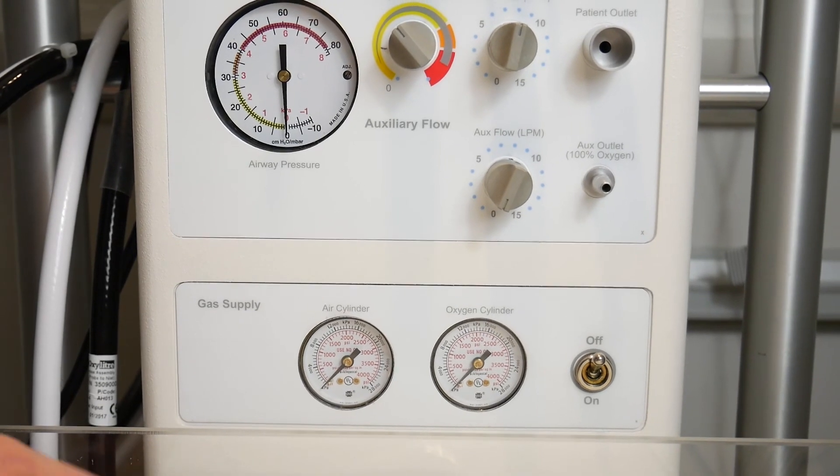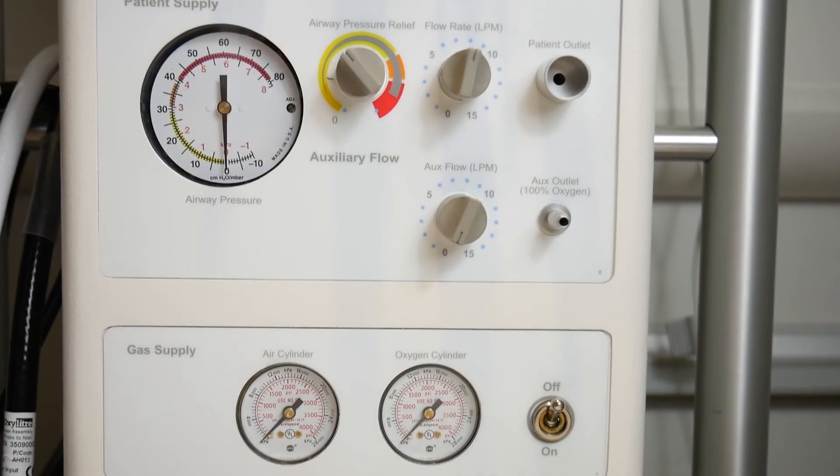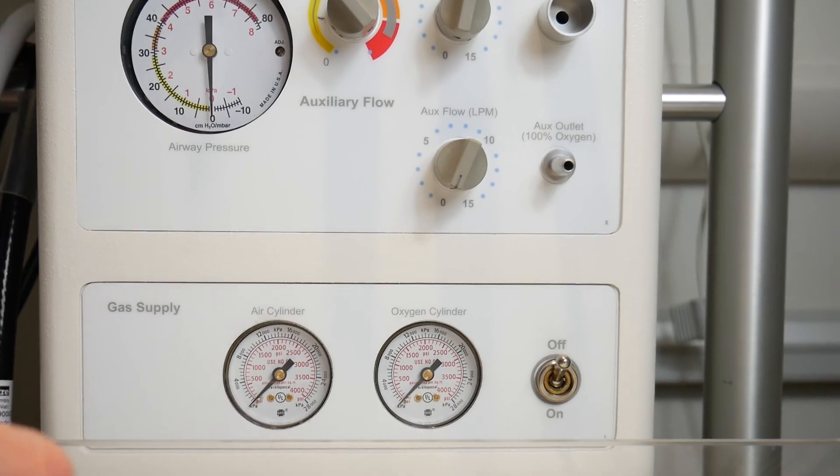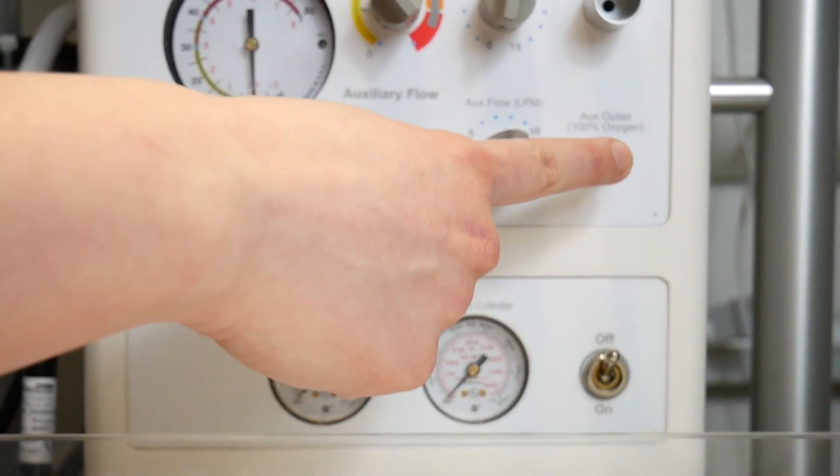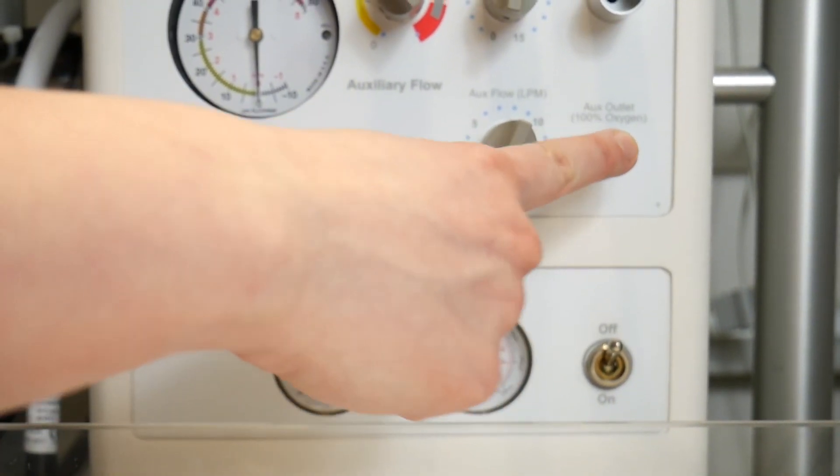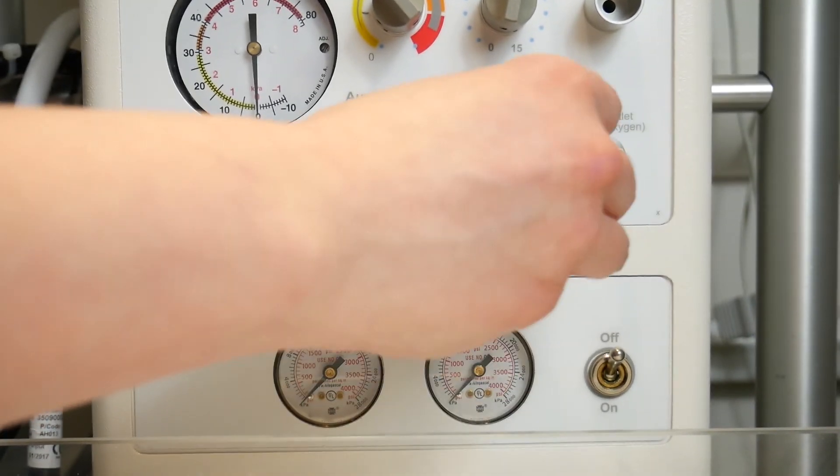Below this you have an alternative gas outlet that always runs on 100% oxygen. You can attach a Waters or anaesthetic circuit here and you adjust the flow rate in the same way as above using this dial.